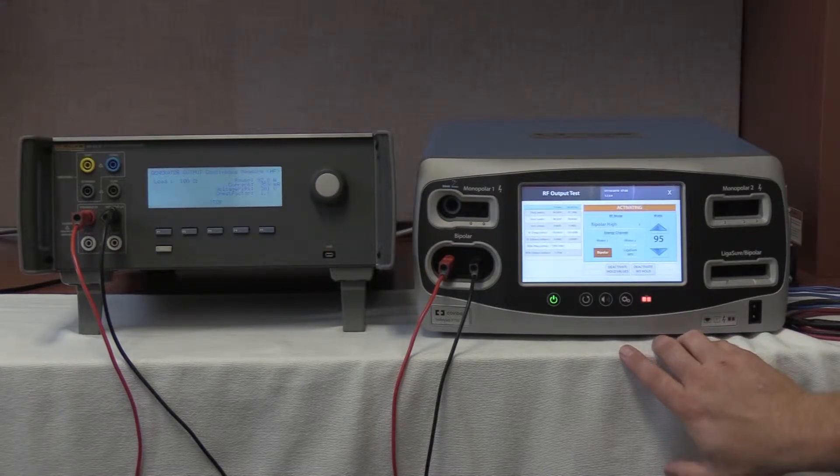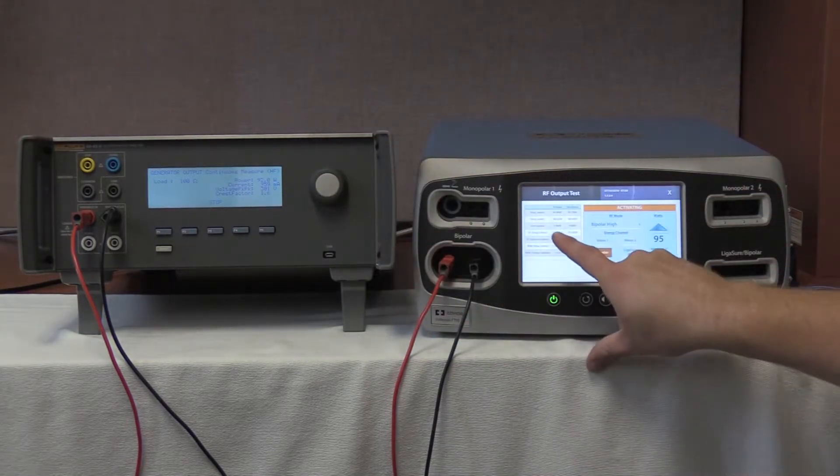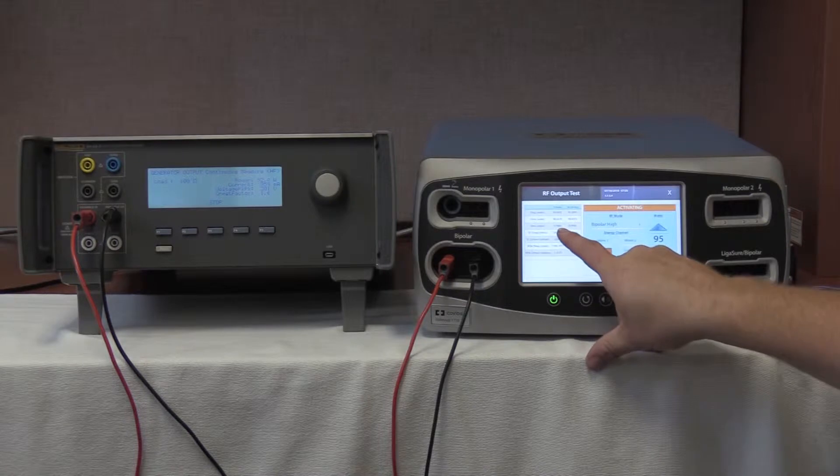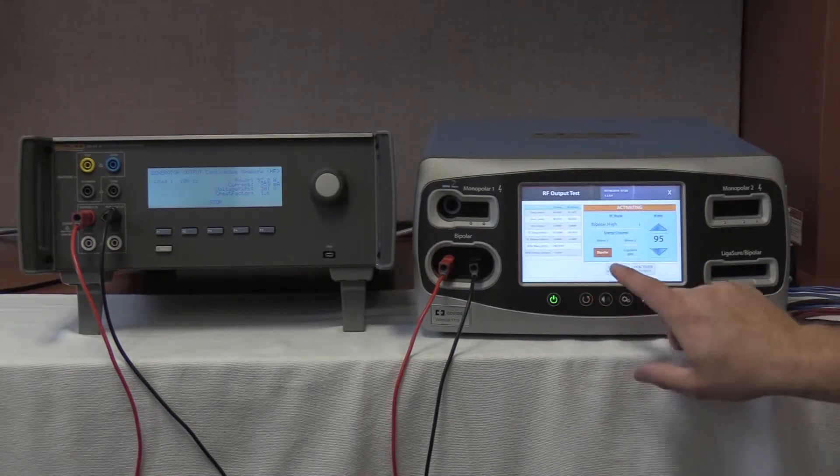Our range is 843 to 1,133 milliamps. We are reading 959 milliamps and we are outputting 968.0 milliamps, while within specification. We are going to deactivate and hold the values on the FT10.